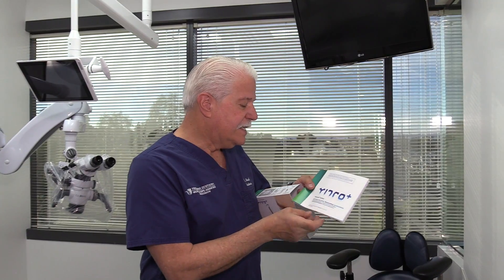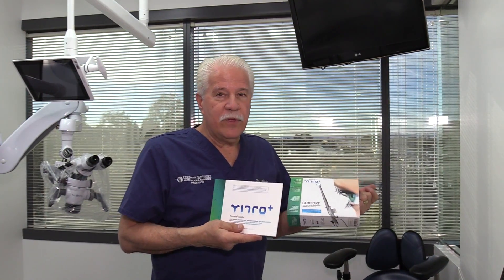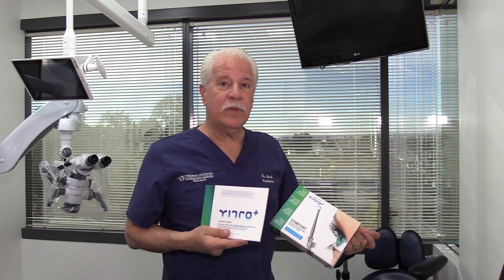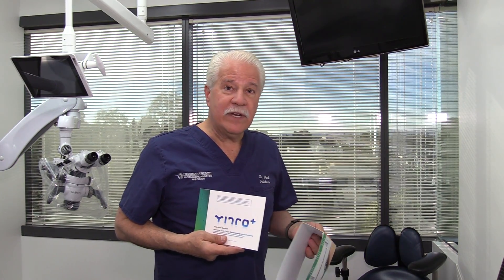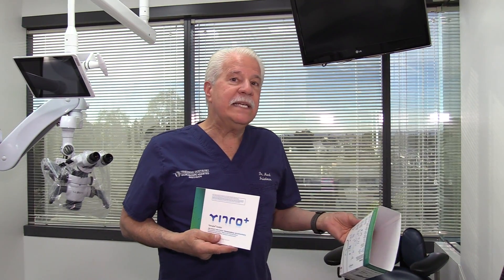What this is, is actually a self-cleaning mirror system. Whether you're working on a microscope as we are, or whether you're just doing routine dentistry with magnification, one of the most frustrating things is when that mirror has even a little droplet of water — especially at 6x or when we're working at 16 or 18x — we can see nothing.